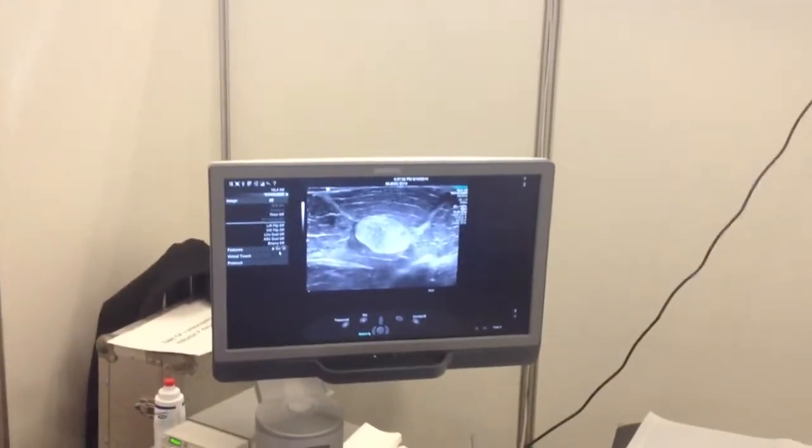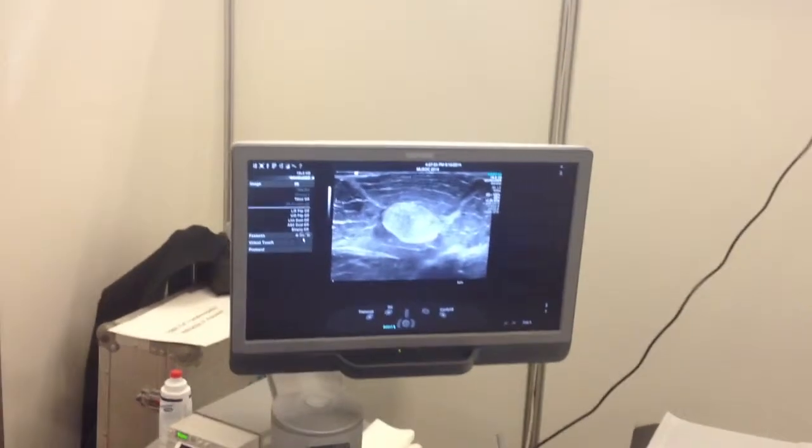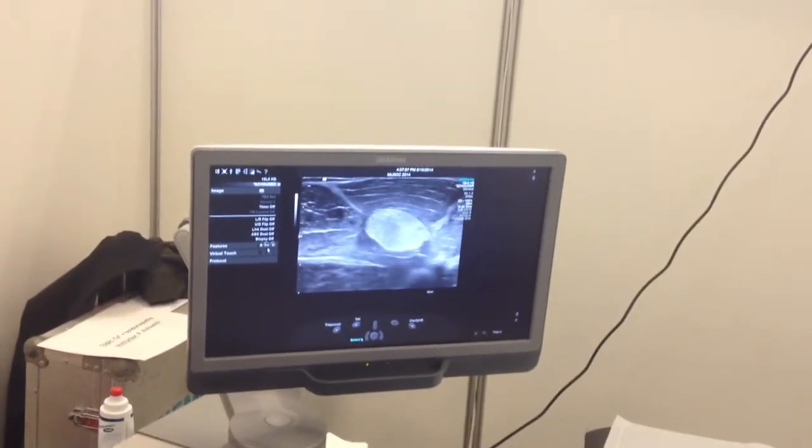It's better to have short feathers. Now we're going to get toward the calcification. Move slowly. Forward.